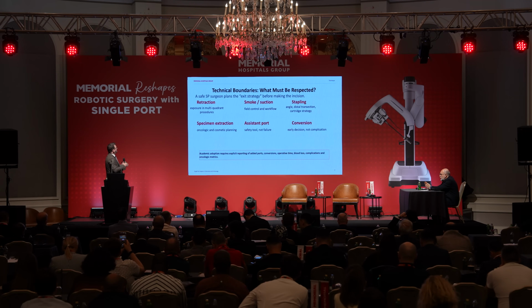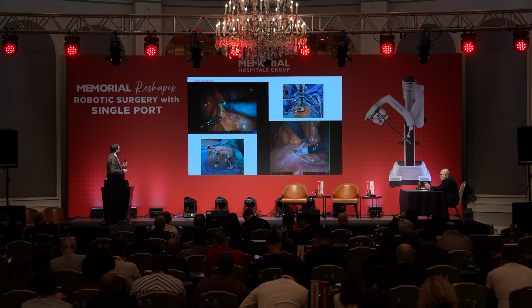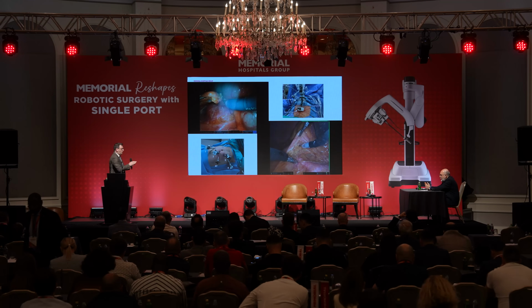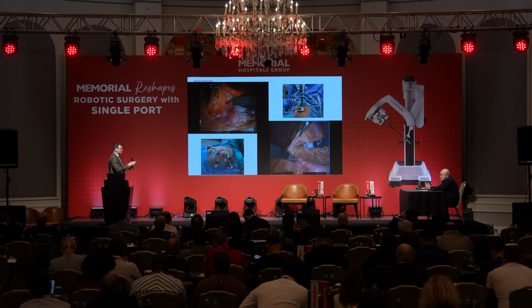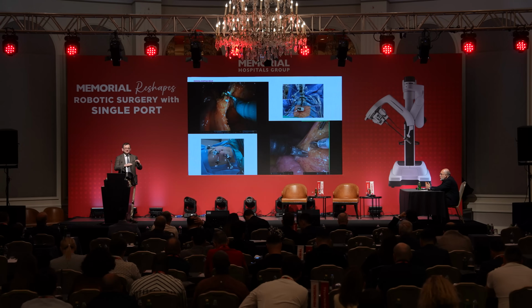You need to apply different approaches compared to the multi-port strategy. This is one of our operations in the upper abdomen with multi-port, and this is our single-port surgical approach. All the information related to the multi-port technique changes with single-port application because the traction areas are small.